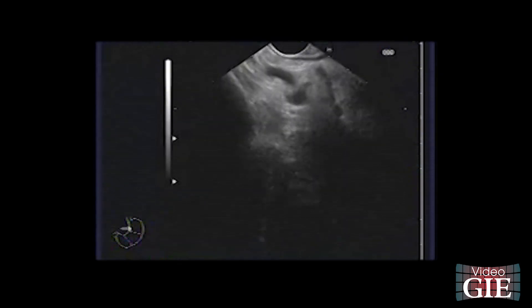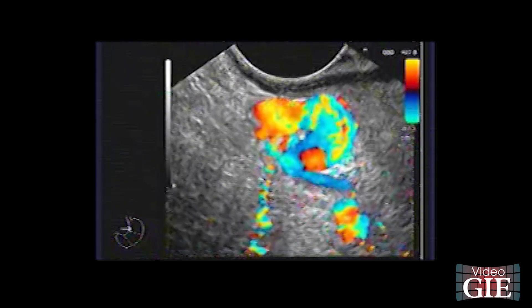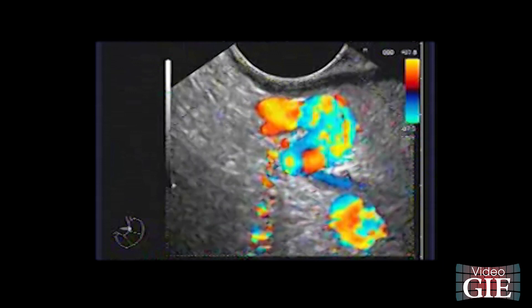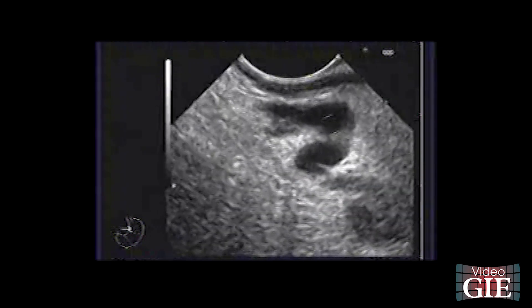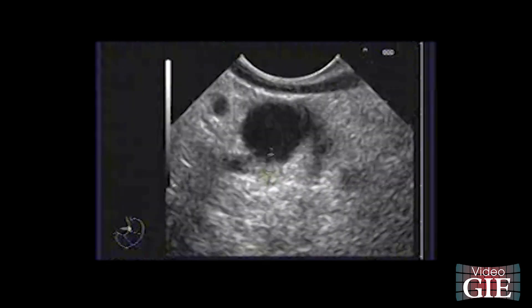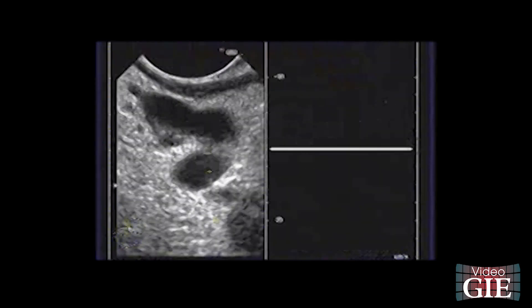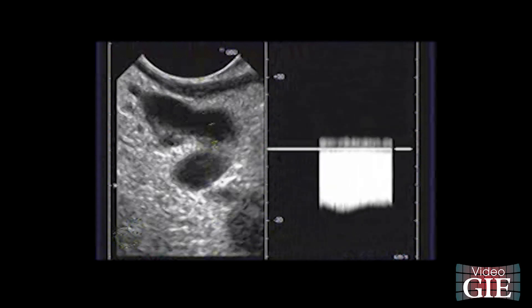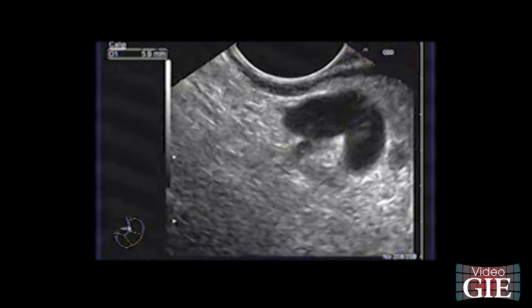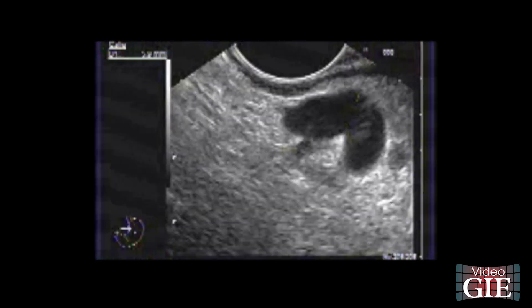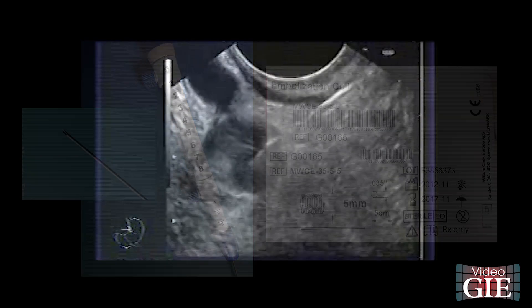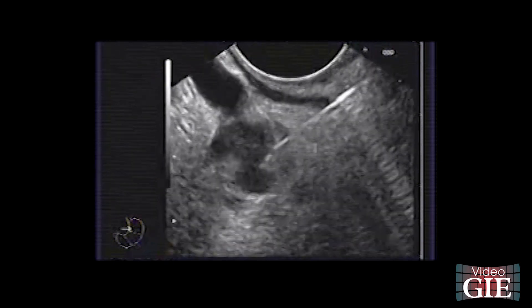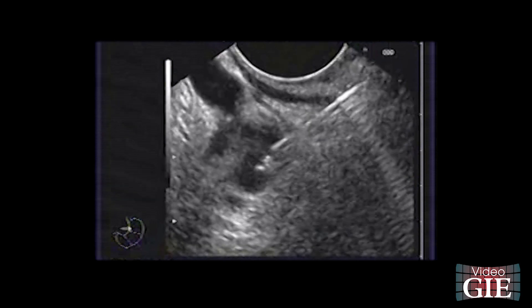As our experience with coils for management of gastric varices and duodenal varices was good, we opted to do an EUS to assess the feasibility of EUS guided coiling. EUS showed a large rectal submucosal collateral varix. The Doppler study showed good flow velocity. EUS guided coiling was done using a 19-gauge needle as previously reported. The varix was chosen based on EUS window and flow velocity, as the chance of migration is less in a low-flow vein. We always try to place the coil in low-flow veins.